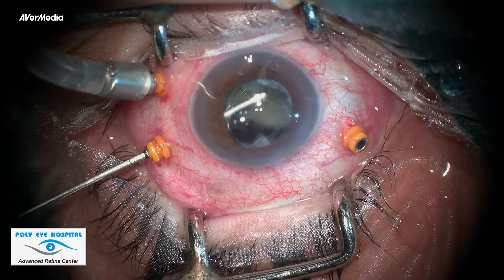I usually reserve Fragmatome for very hard cataracts like grade 4 or 5. Mainly because to use Fragmatome, we need to extend the scleral incision, which increases the chances of dialysis, hence retinal detachment. The second reason is the infusion cannula is 23-gauge whereas Fragmatome is 20-gauge. This mismatch causes fluctuations inside the vitreous cavity, hence chances of iatrogenic tear increases.